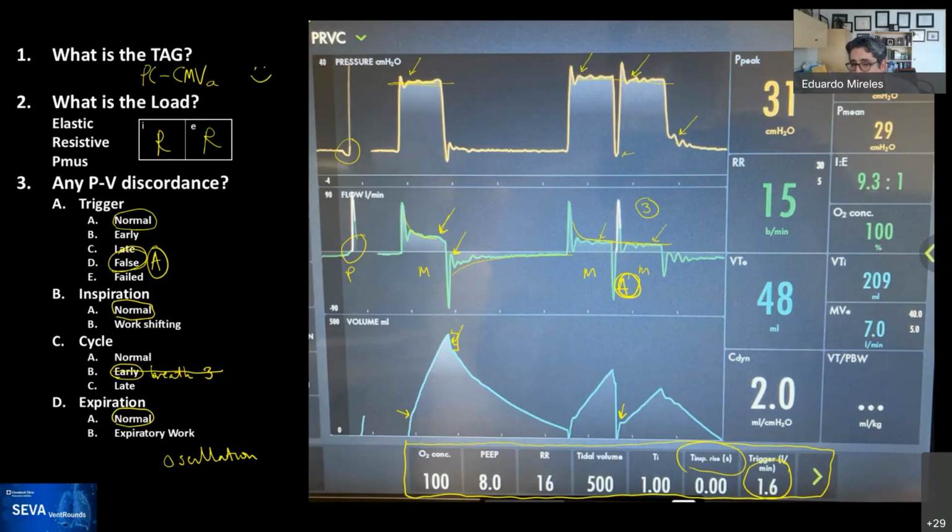You have to go after the cause without a doubt. Hara wants us to check the tube. Absolutely. That's another common thing. You have a patient with COPD, and he has mucus that starts building up, and you can give as much bronchodilator as you want. It will not dilate the ET tube. So great point. And there's a question, Rob, what do you think about Ariel's question?